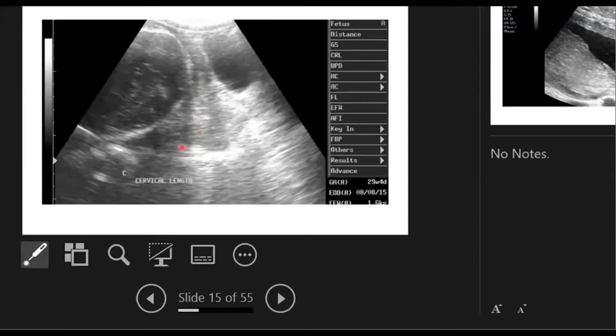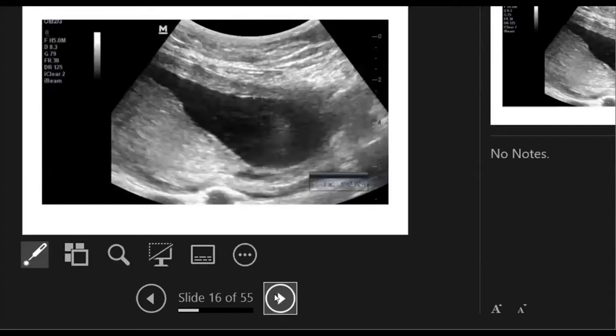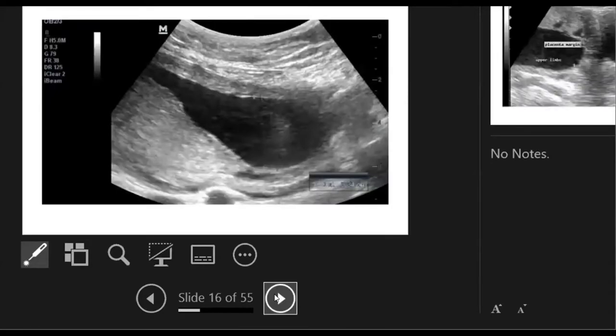So you cannot examine the baby in this position and say we have ruled out placenta previa or a low-lying placenta. You need either to move the baby away and have a pool of liquor between the baby, placenta and the cervix so that it gives you a window to examine the structures. You can push the baby away or you put fundal pressure so that you push the fluid to go just above the cervix.